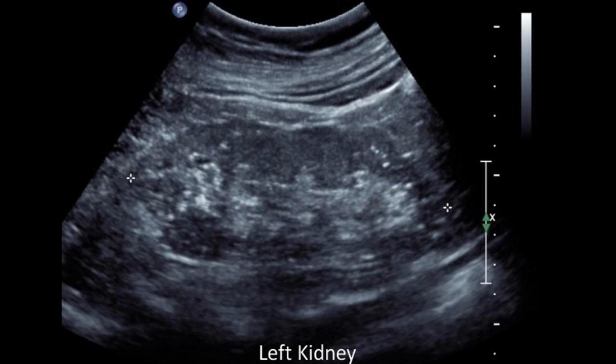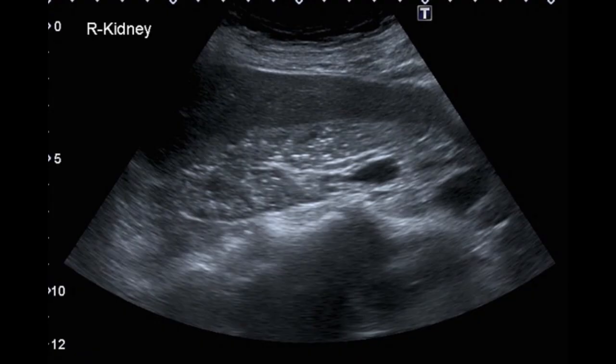It includes numerous uniform microcysts and punctate echogenic foci, which may be cortical or medullary in origin. The kidneys are normal in size. As you can see, it might be easy to mistake this for several cysts or maybe even a more malignant cause of pathology.